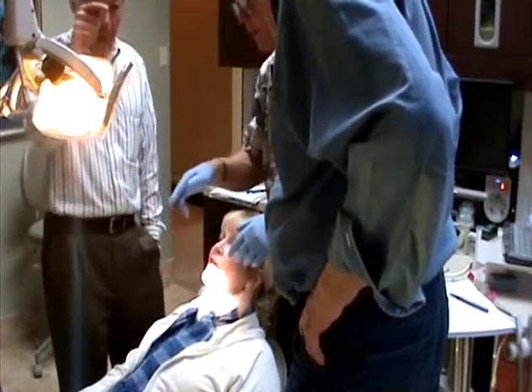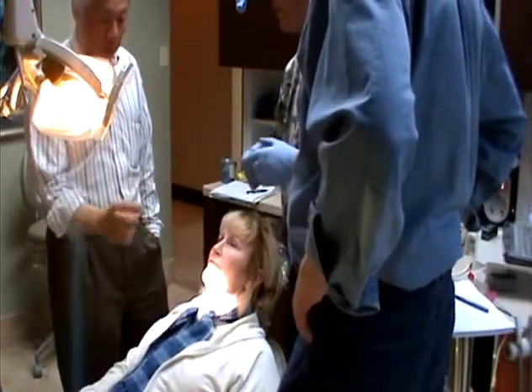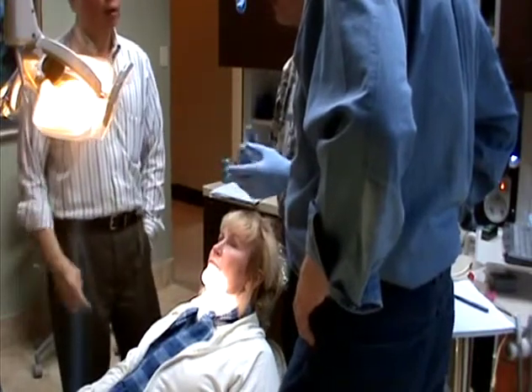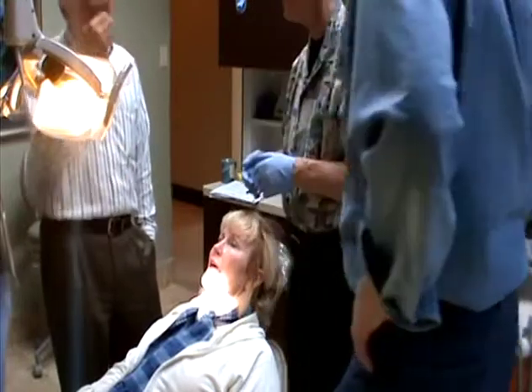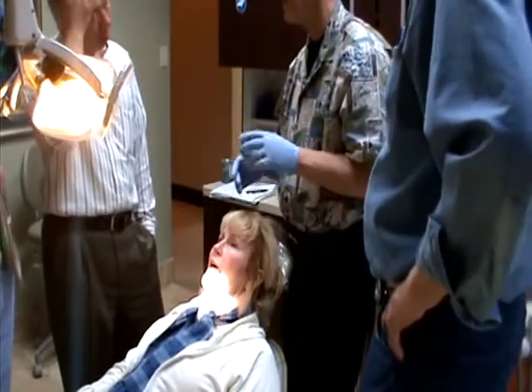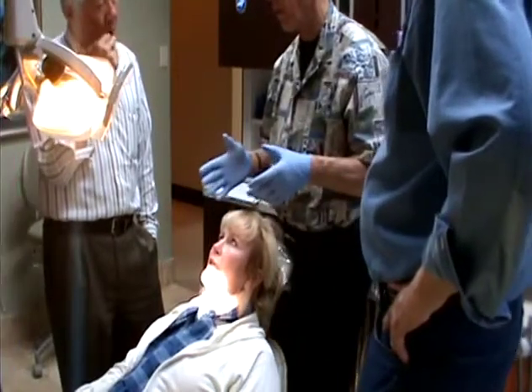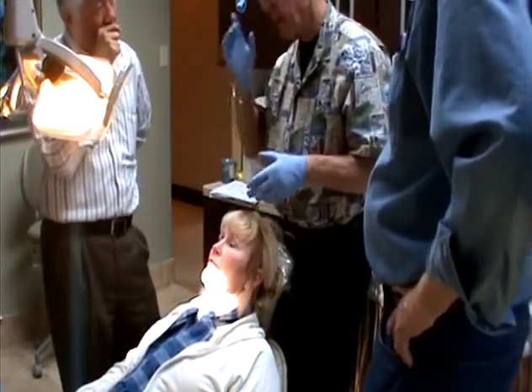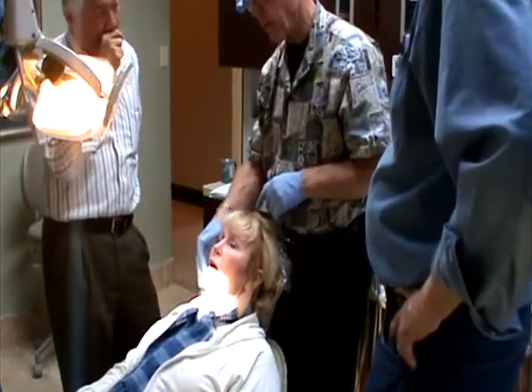The elastic up end will be this way. Up end's up where you want that tooth to go. You have to put that in, it basically compresses this thing. You use a spring wire, so you bend it up in the direction that you want the tooth to go. A nice springy wire that'll bend. 016, stainless steel usually? An 016, maybe an 014, 016 at least. You put this up bend in there, and then you wear a triangular elastic from the molar up.